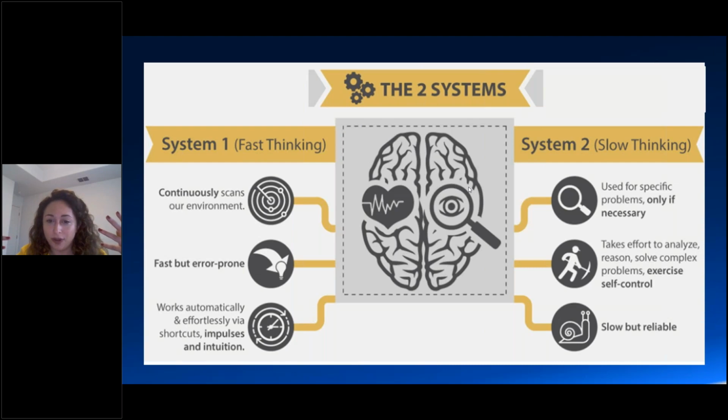I could not multifunction. Versus compared to when you were driving this morning, very different behavior. So I don't want us to use system 2 every time we look at a CBCT scan. It's just not efficient. But at the same time, we need to learn a new system 1.